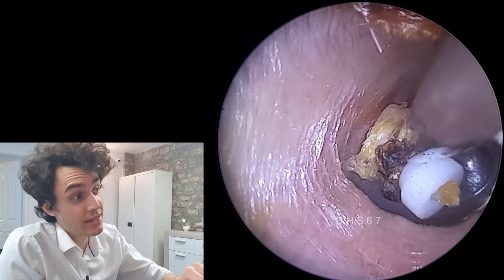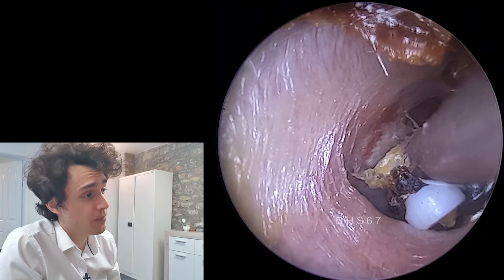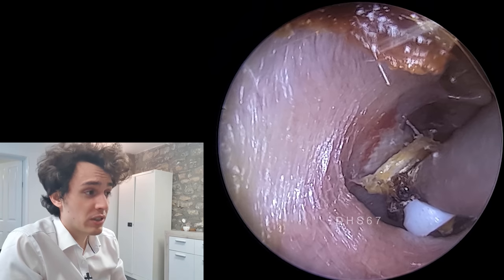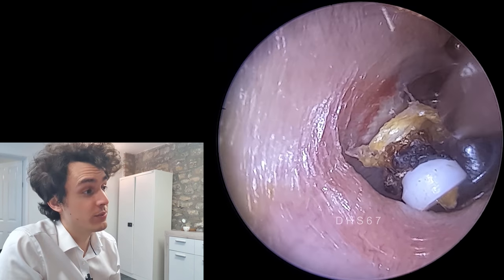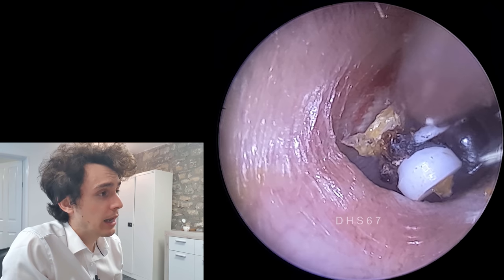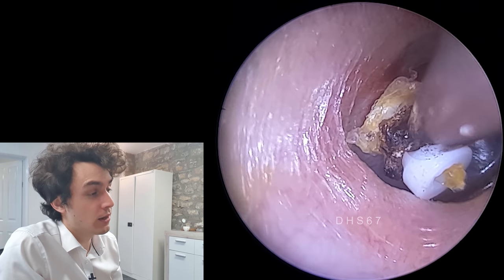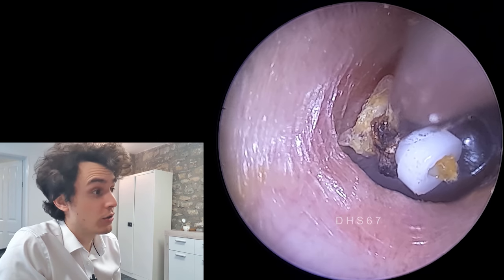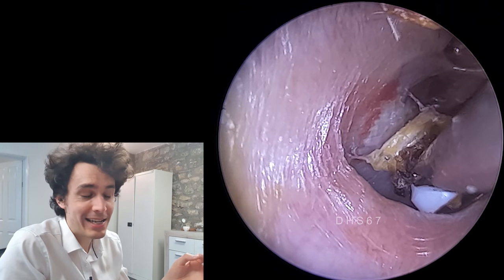You can actually see where it was adhered — you can see some dead skin, that white debris on the eardrum there. Some of you are probably wondering why I don't just go down and fish it out with some crocodile forceps or a hook. But that would be incredibly dangerous to go that deep with a large pair of forceps or a hook. The suction is doing a fair job — we just have to be very gentle with it because it's adhered.